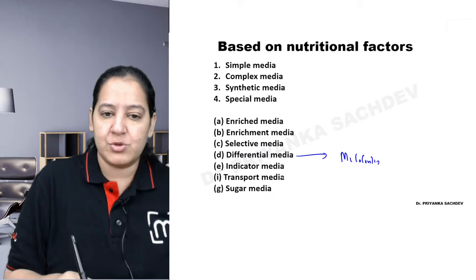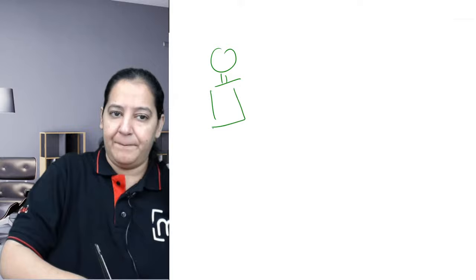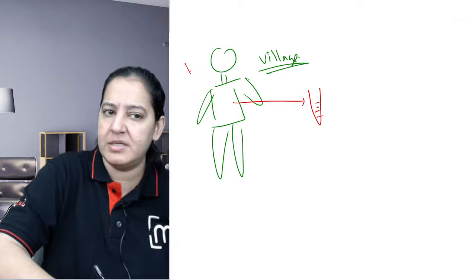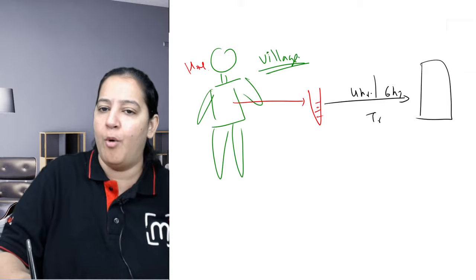So coming to the next one, the last one is transport media. As the name indicates, transport. What do you mean by transport? Imagine this is my patient. The patient is residing in a village, in some periphery. The patient is sick, so I want the specimen to be collected and the test applied. A person goes to the home of the patient and collects the specimen. But where is the laboratory? Laboratory is far away. It requires 4 or 5 or 6 hours for the transport of the specimen to the laboratory for applying the test.